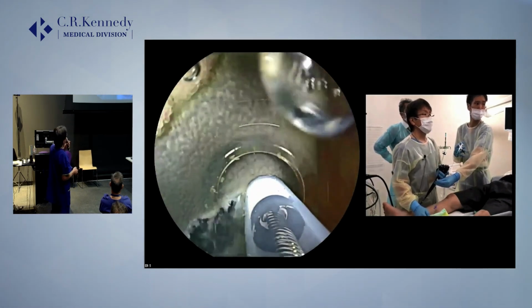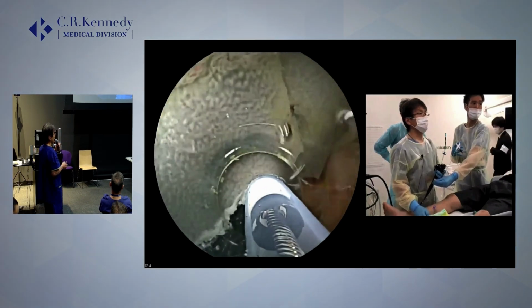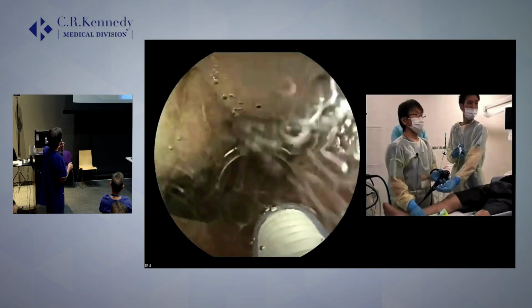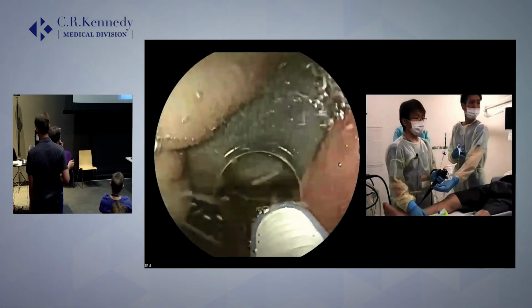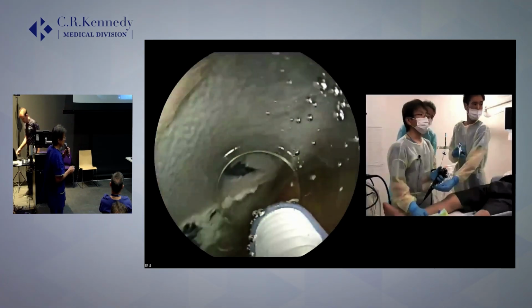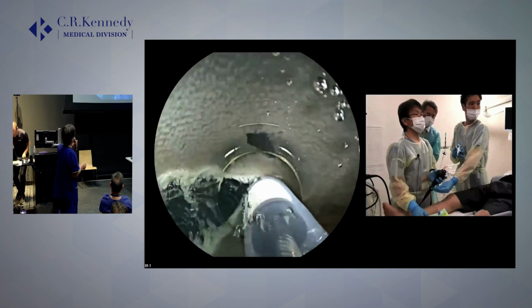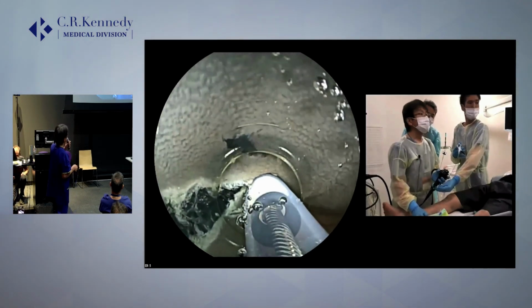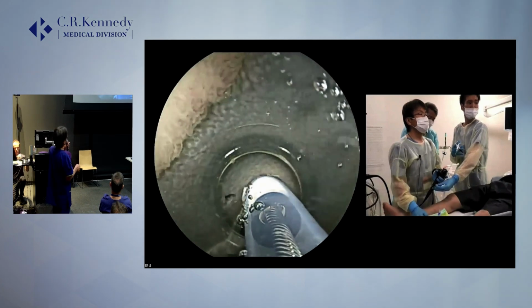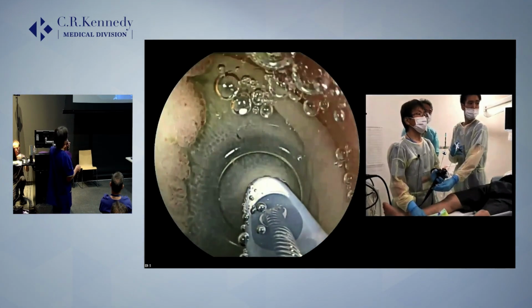Recently, I use underwater technique. And actually, this is not water, this is saline. I use continuous saline perfusion, and currently available short double balloon endoscope doesn't have a water jet channel yet. So I infused the saline through the flash knife. And continuous infusion of the saline through the flash knife.